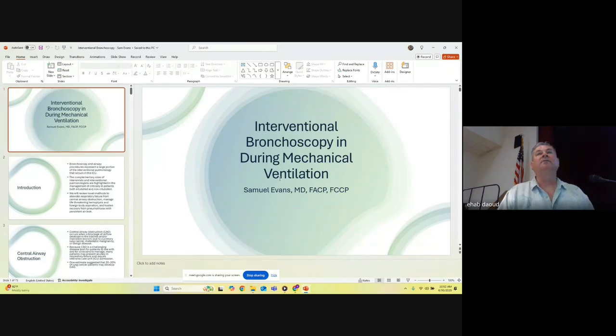Thank you so much, Dr. Evans. Any questions for Dr. Evans? Do they use rigid bronchoscopy anymore? Some institutions do. When I trained, there were interventional pulmonary fellowships, but now you do an extra year and you can do an IP fellowship and they'll train you to do it. And the thoracic surgeons are trained to do it, but I rarely see anyone use it because our tools with the flexible scopes are so good now.